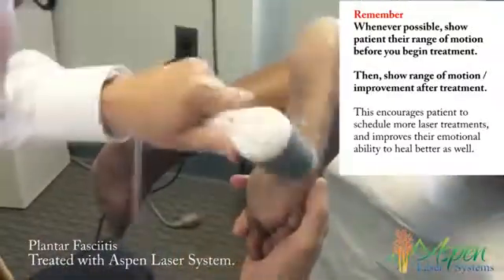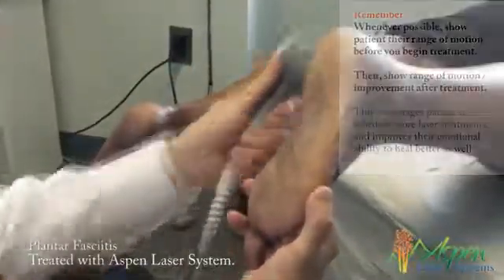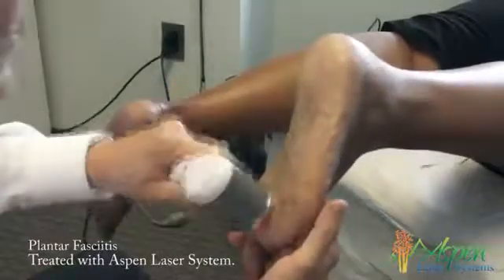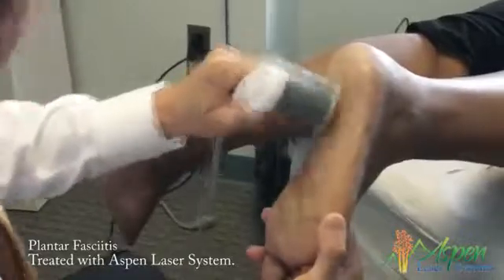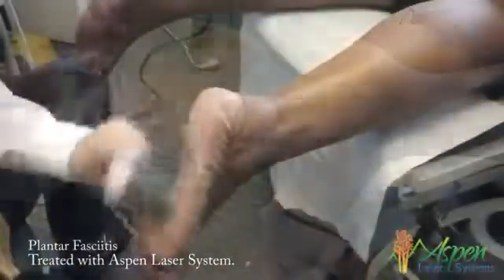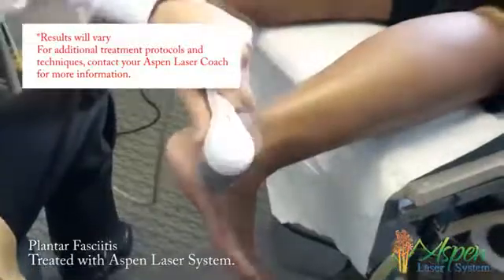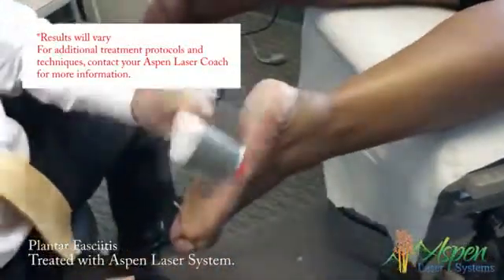You want to get the lateral band, the medial band, up through the tarsal tunnel, the posterior tibial, the tarsal tunnel, the medial band. For sesamoiditis, neuroma, or neuropathy you can treat those too, but the two big ones are Achilles and plantar fasciitis.